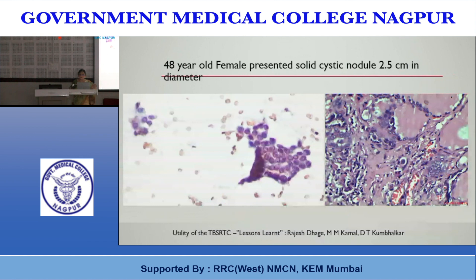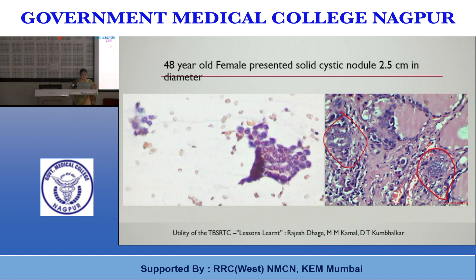A smear from a 48-year-old female with a solid-cystic nodule 2.5 cm in diameter showed mild atypia with nuclear clearing in most cells, rolled edges, and central pale areas. We reported this as suspicious for papillary thyroid carcinoma; however, histopathology showed multinodular goiter. Excessive reliance on one feature may lead to false positive results. Alternatively, such features may also turn out to be PTC — so if you are not sure, place the cells in the AUS category to retain the option of repeating FNAC.